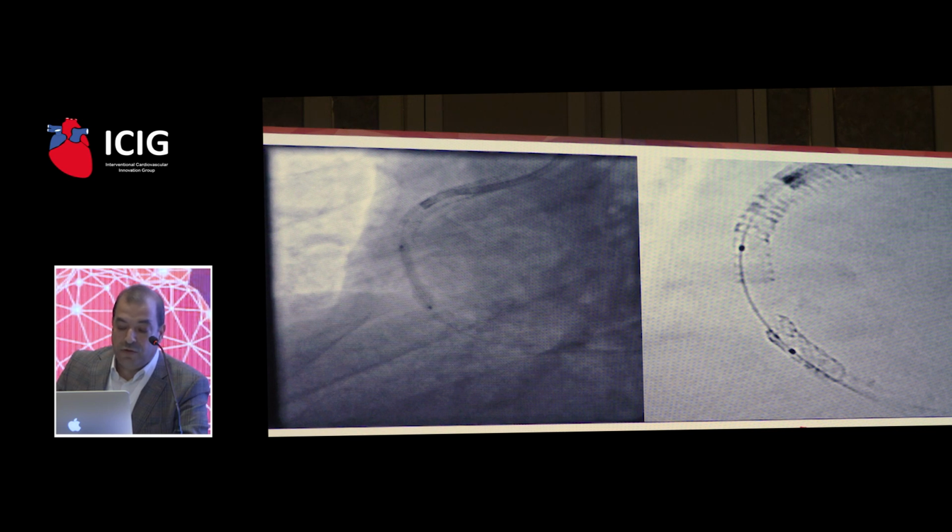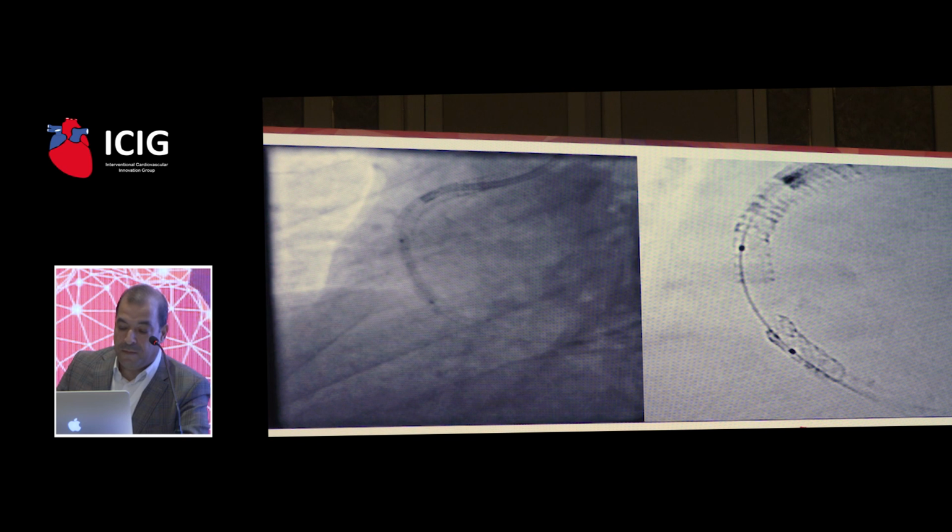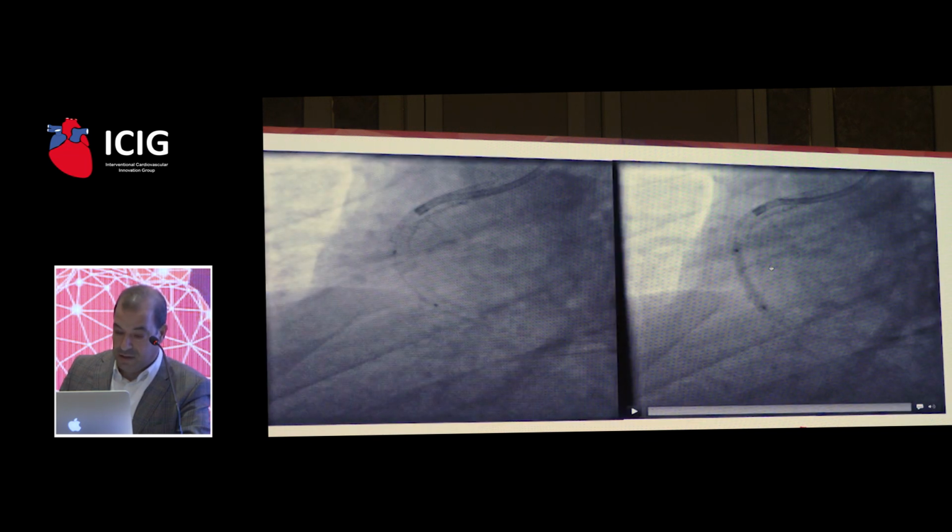Here is just to show you, with the stent boost, that part of the stent was placed proximally and part of it was fractured and displaced distally. I'm not sure it's very convincing, honestly. Show us proximally where you think the first part of the cut stent is. This is the cutoff of the previous stent, and this is my stent that I just placed.